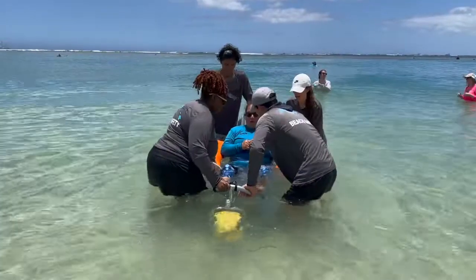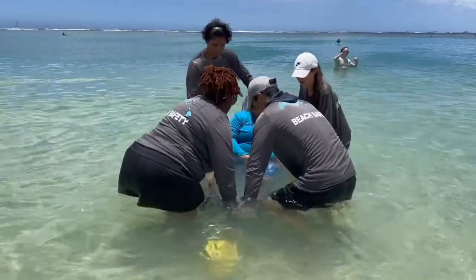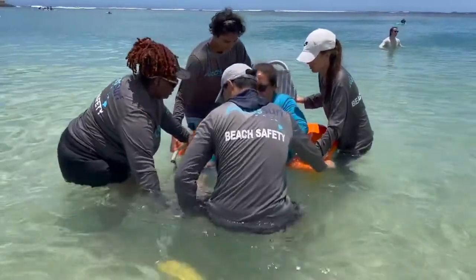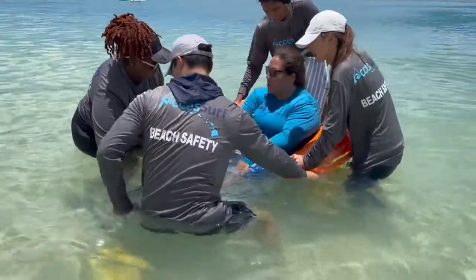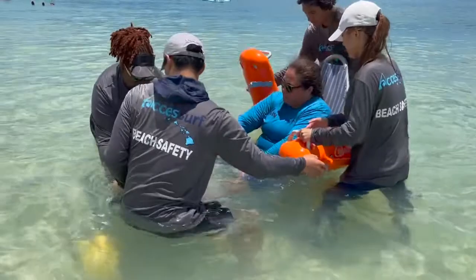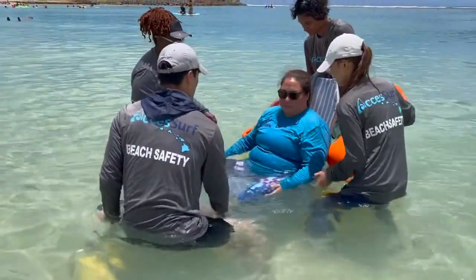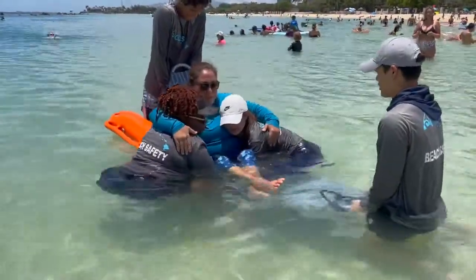Prior to initiating the transfer, volunteers will use their weight to sink the chair on the count of the team leader. Sinking the chair will make it easier for the participant to move from the chair into the water. The person in the front can sit on the front bar, the person in the back can stand on the back bar, and if there are people on the sides, they can kneel onto the wheels. The armrest can be removed if needed. It is important that the team sinks the chair together so it doesn't tip over.